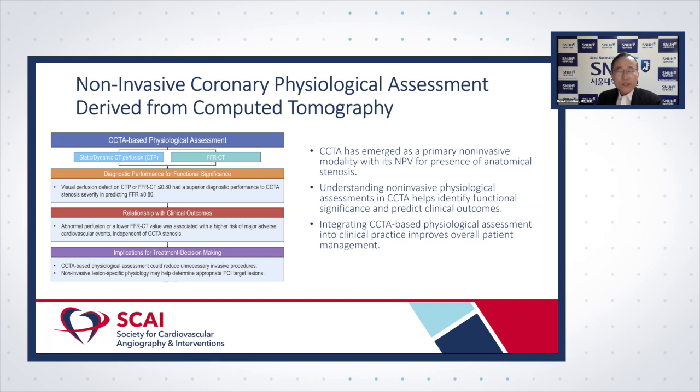death. Having said all that, I think that CT-based physiological assessment now, along with the quantified and qualified CT lumen and plaque assessment, can definitely improve our care for patients with coronary artery disease and improve the patient outcome while providing the appropriate treatment based on the knowledge we derived from the CT scan.